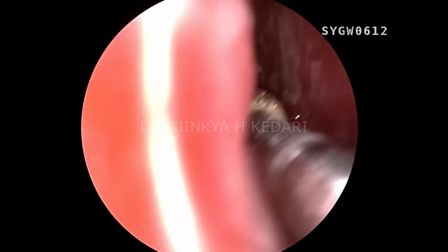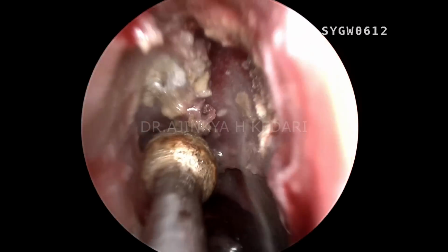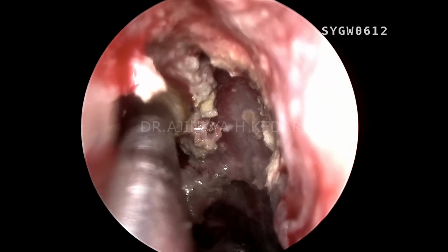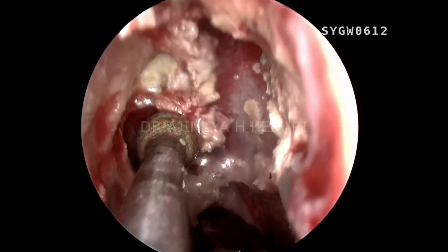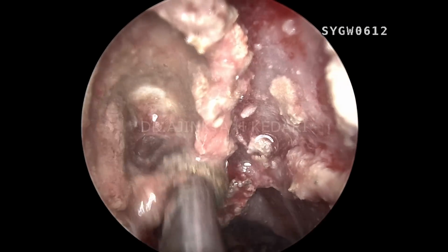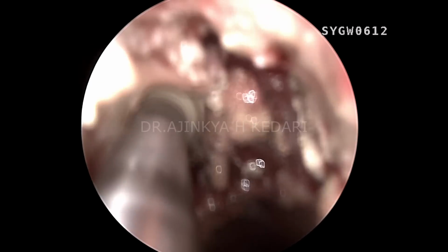See, at your 9 o'clock, that's the skin, you can see very clearly. Make sure you do not drill through and through the skin, otherwise that's going to be an issue for the patient's cosmetic appearance. See, that is all skin, very soft right there, and anything behind that, if there's a bone left, you have to drill that. So make sure once the skin has reached, you're not supposed to drill beyond that. Now this is all frontal beak, which I'm going to drill right now in some time.